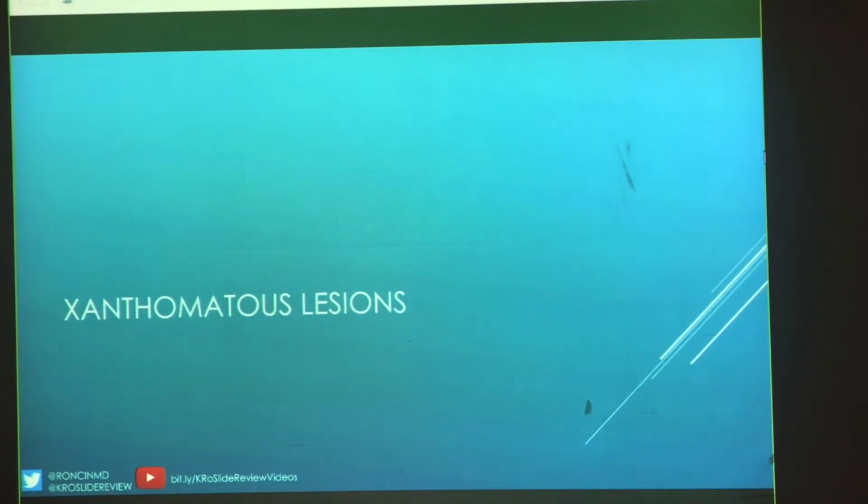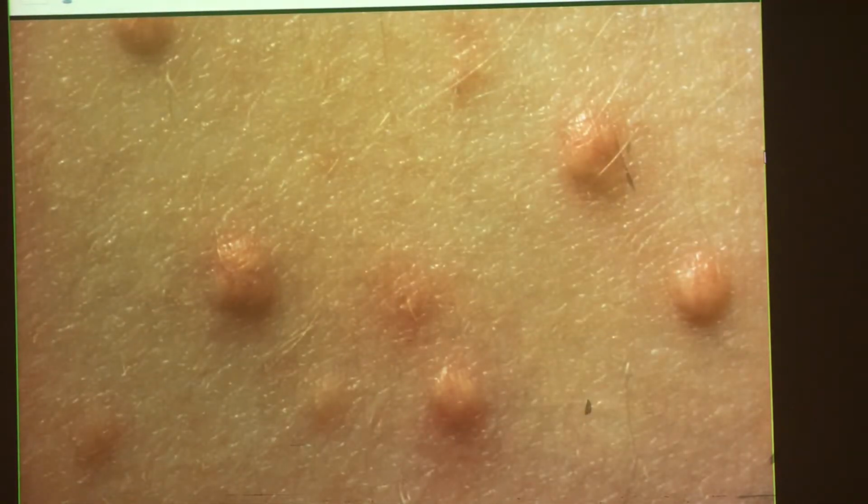For a lot of these, I tried to pull clinical pictures where I could, so that you can try and pair that up with the slides as well. Case 1. Nodules, yellow. Excellent. Yellow nodules. Okay. Less yellow, but nodules nonetheless. The projection over the projector isn't quite as crisp, but they do look maybe a little erythematous around the base on the computer screen.